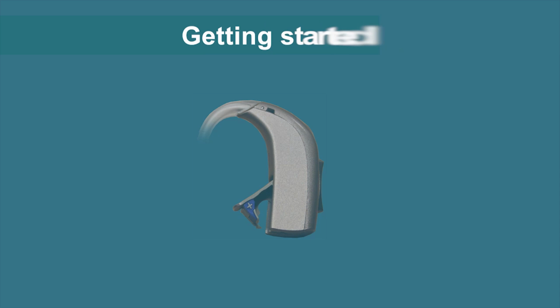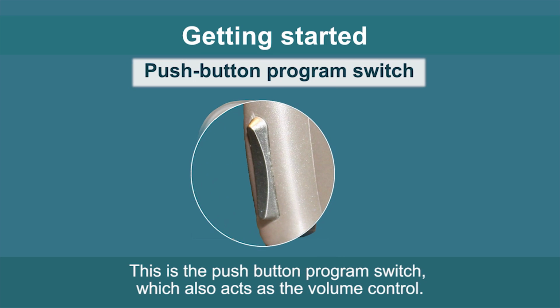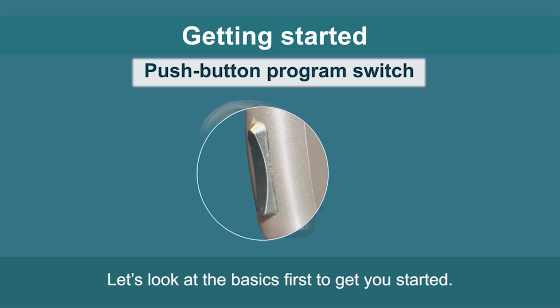Getting started. This is the battery compartment, which also acts as the on and off switch. This is the push-button program switch, which also acts as the volume control. Let's look at the basics first to get you started.